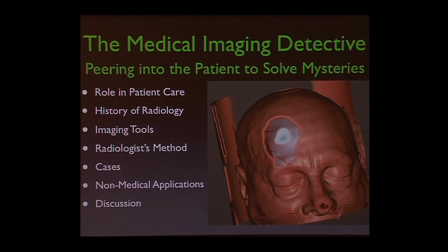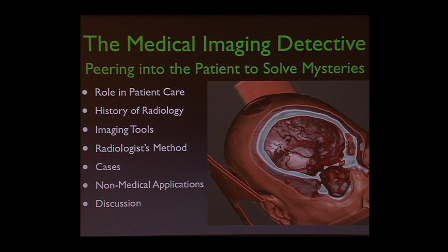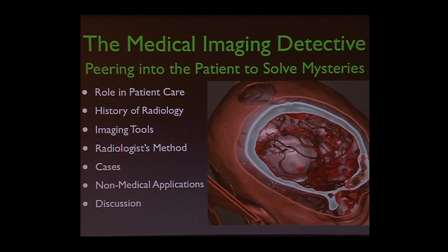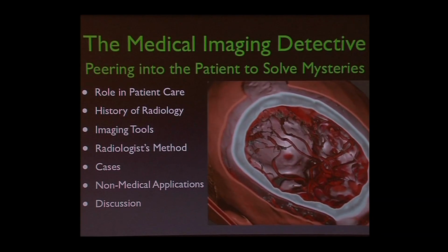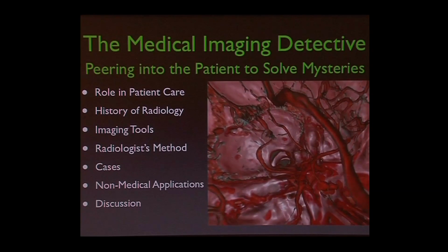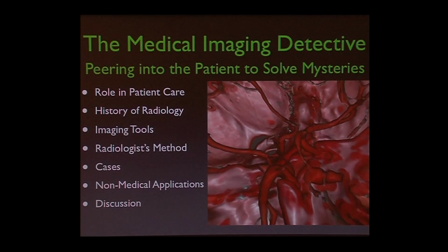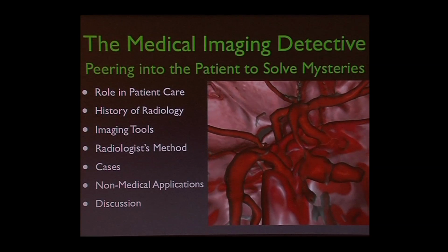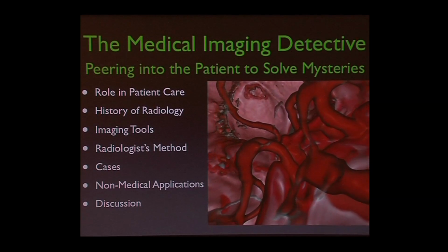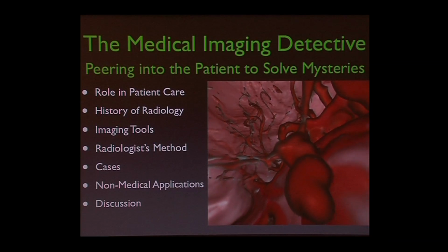I will go over a little bit about the role of radiology in patient care, the history, where did it all start, and where did it go through the years, and what imaging tools we have. Like this is a 3D of a CT scan. It's just a conventional head scan that I've converted into a 3D rendering to give more information and more perspective than you can get out of the original CT.